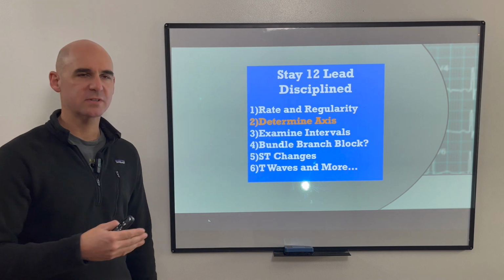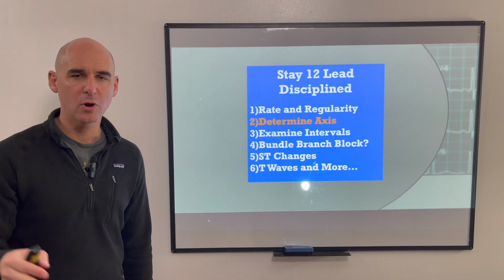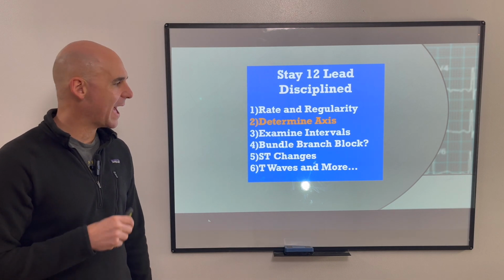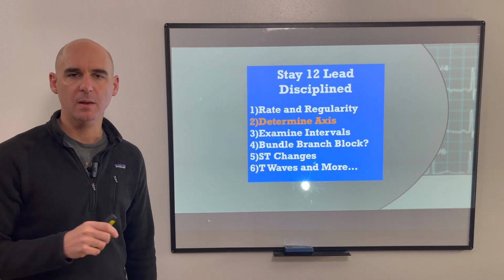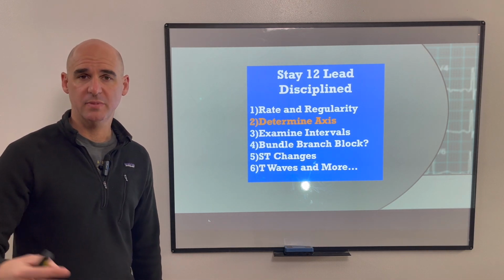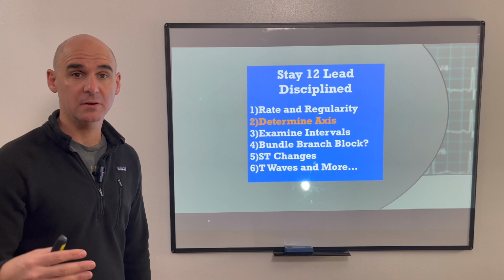So remember, stay disciplined with your 12-lead approach. It's going to help you tremendously. We have one more video in our axis video series, and we're going to talk about extreme axis deviation and some things that potentially indicate ventricular tachycardia.